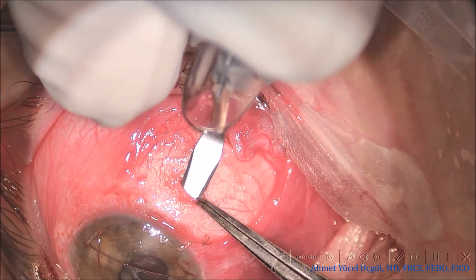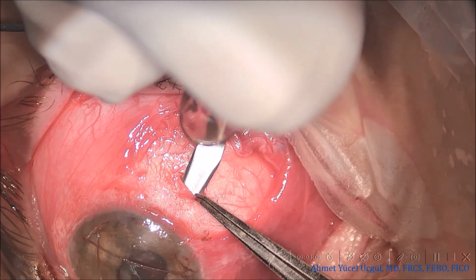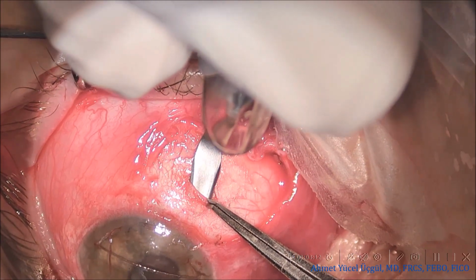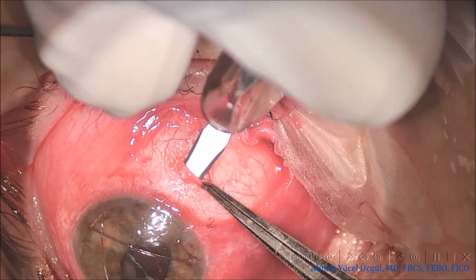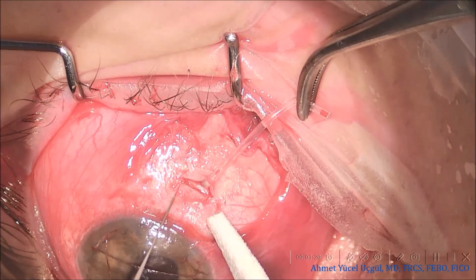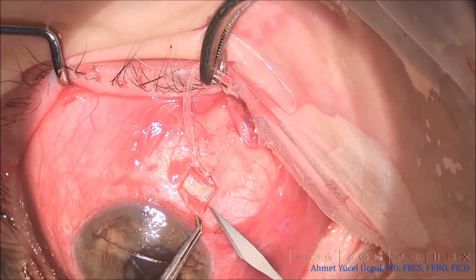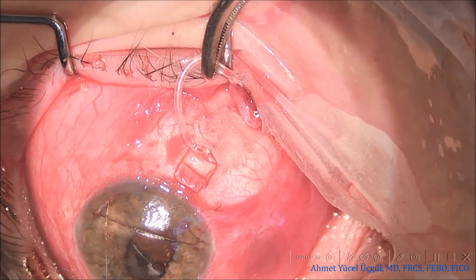Using the limbus parallel scleral incisions as the starting lines, I dissect a partial thickness flap at approximately 80% scleral depth. As in the first case, this thickness is intentional. It provides sufficiently robust coverage over the tube, helping to reduce the risk of postoperative erosion of the overlying sclera. The flap is not extended all the way to the limbus. Instead, it is stopped about 2 mm posterior to the limbus, leaving the most anterior portion intact for controlled tube entry. The main purpose of this flap is to cover the tube along its anterior course, thereby helping to prevent early peritubular leakage and offering long-term protection against late tube exposure.